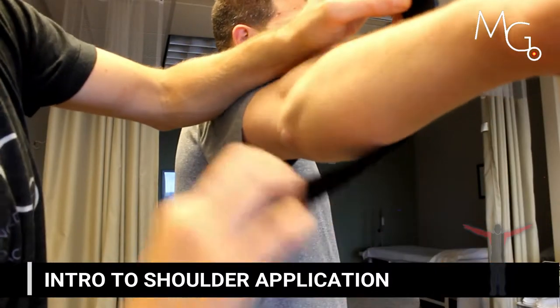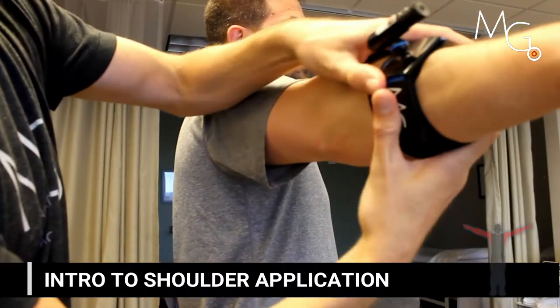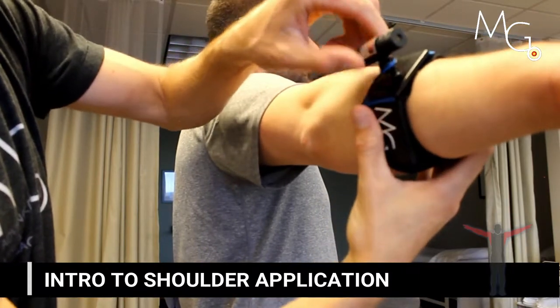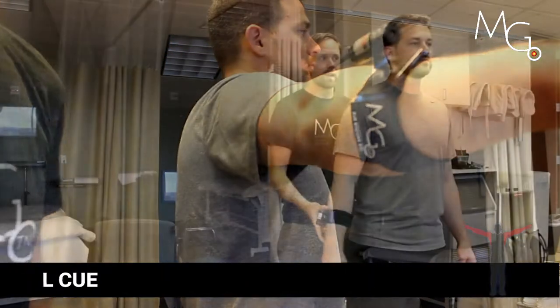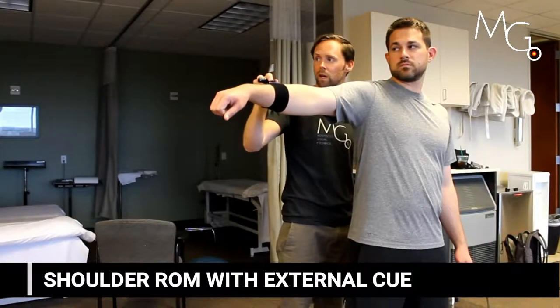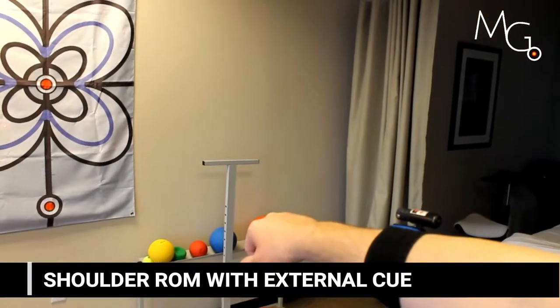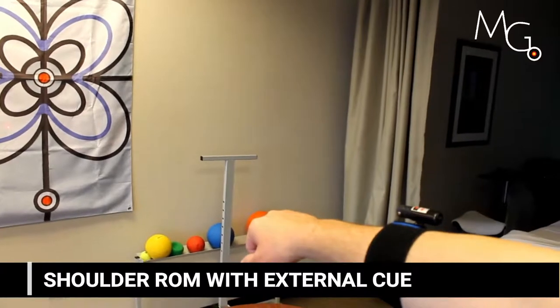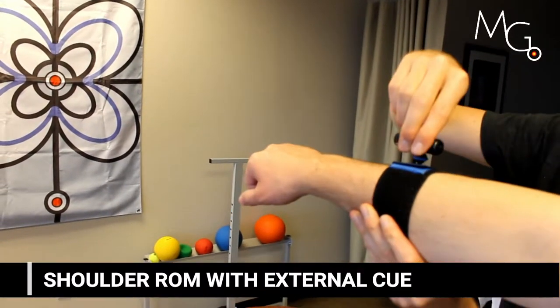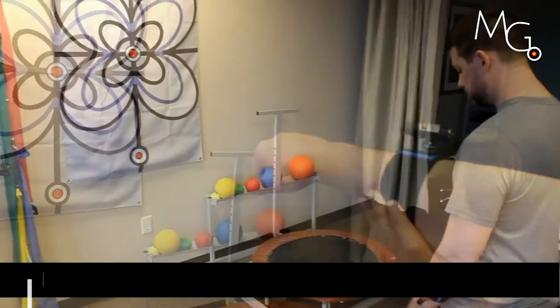This introduction video is going to run through some of the shoulder applications that you can apply motion guidance visual feedback to in clinic. For starters, you can use motion guidance as a visual cue to guide the patient through range of motion. This way they can visualize the amount of motion they have as well as control of the motion in different planes.